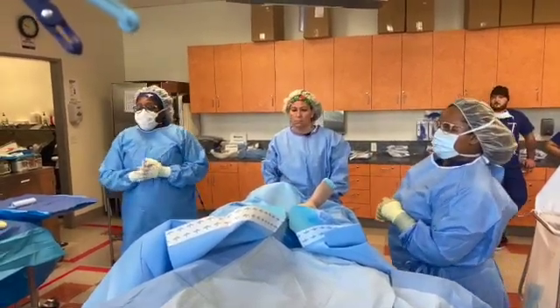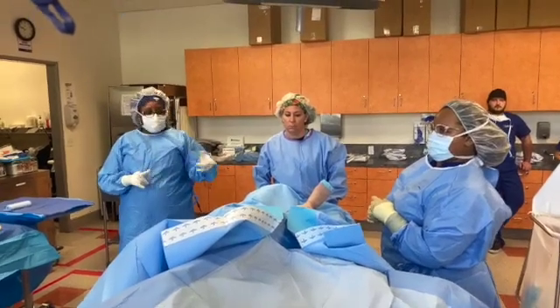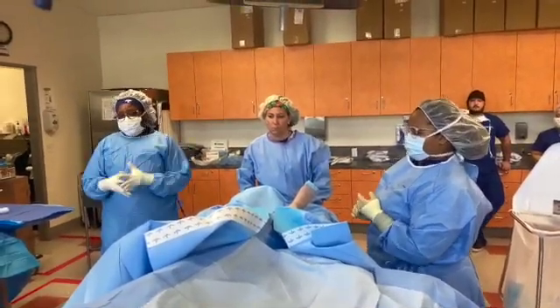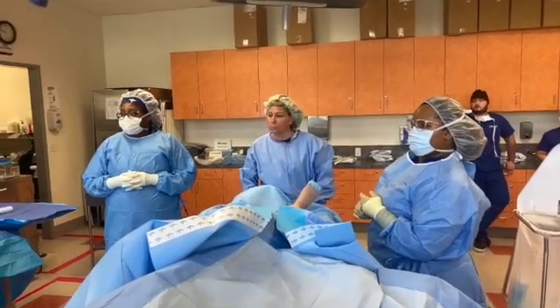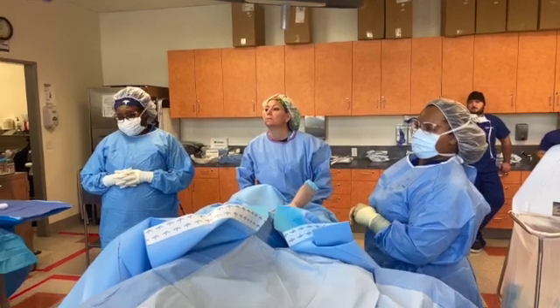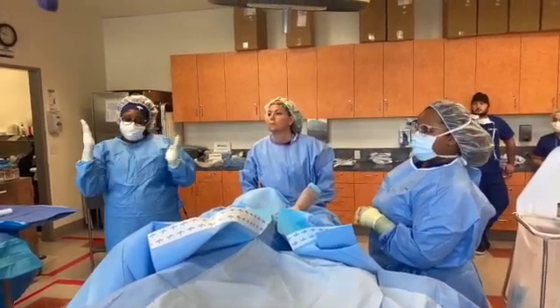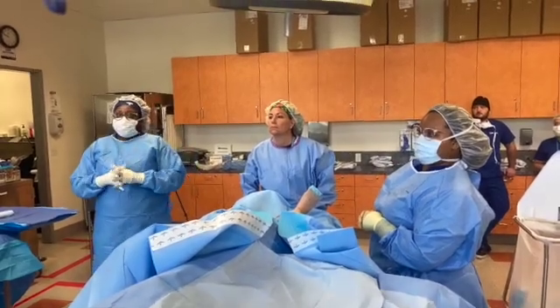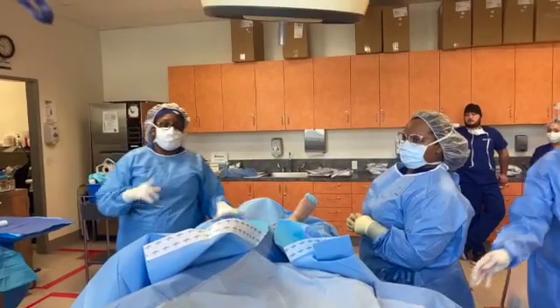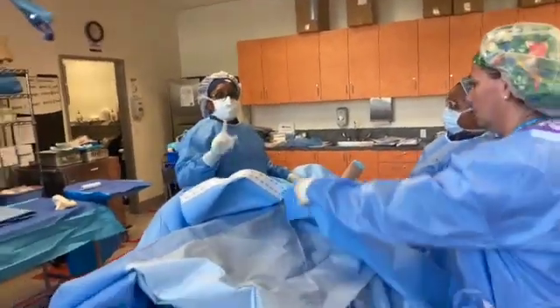With the assistant holding the foot, student moves foot and lower leg through an aperture drape correctly and positions it above the knee, correctly passes the upper portion of the drape to the anesthesia provider. Removes paper backing from the inside drape and wraps it correctly around the knee, further securing the drape edges. Throughout the procedure, the student maintains aseptic technique, opens drape folds with minimal movement, avoids contamination throughout the procedure, deflates tourniquet cuff at the end of the case. Perfect. Case is done. Tourniquet down.